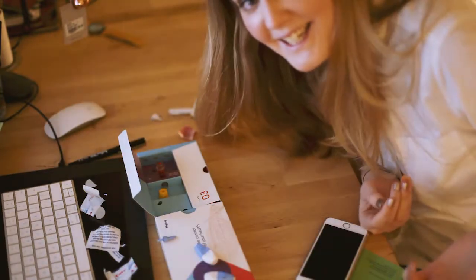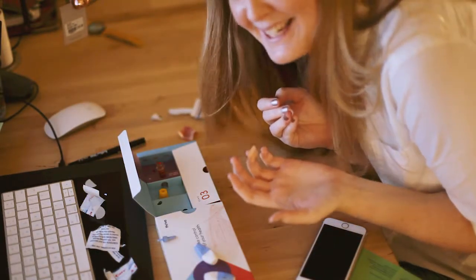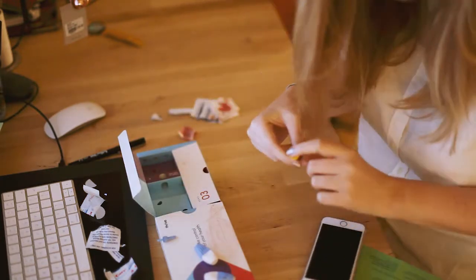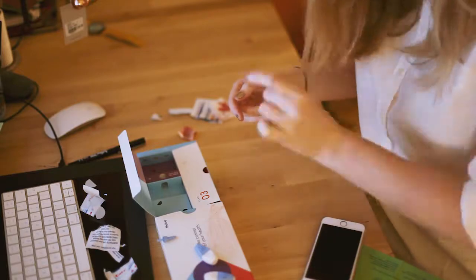I did it! And it only took three fingers. Here's my little tube of blood. I just need to attach the sticker to it.